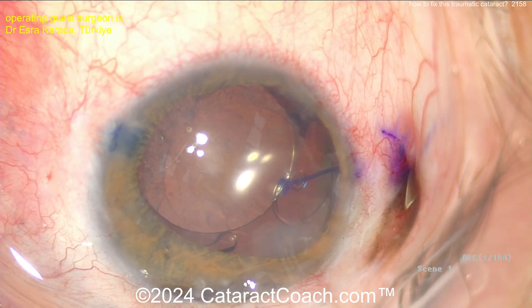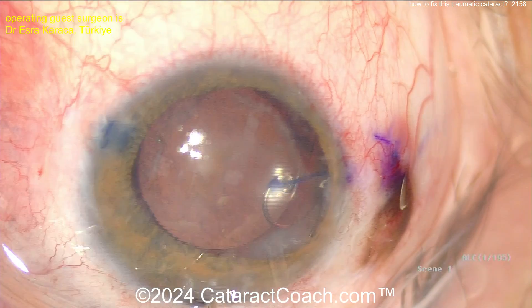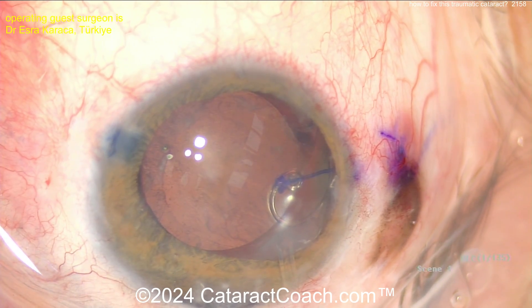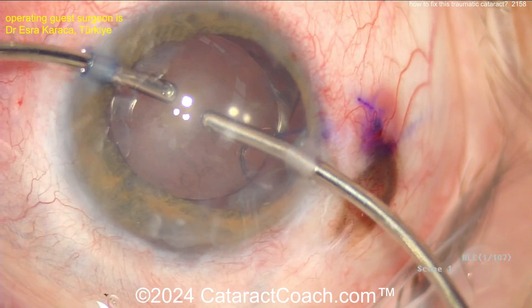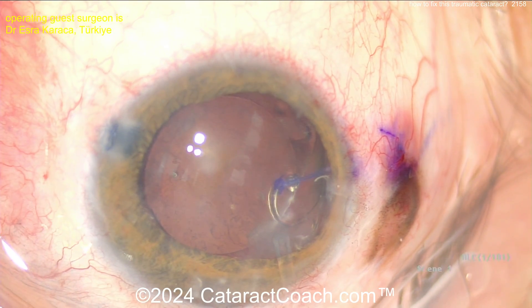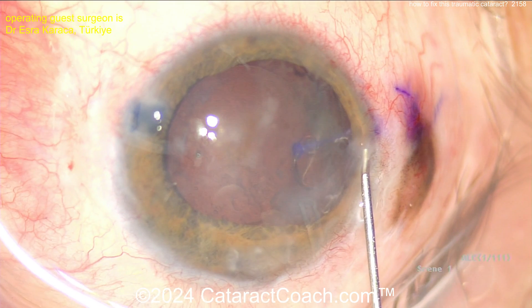I enjoyed watching this video — a nice step-by-step approach. Got to be cautious with trauma; you never know in these cases. Nicely handled with that vitreous prolapse. I may want to tighten up that prolene suture a little bit and have a smaller flange so it can be buried within the sclera and not just sitting under the conjunctiva. A neat case with a lot of great learning points. I'd also put a miotic agent in to bring down the pupil, and maybe restain with triamcinolone just to make sure there's no more vitreous prolapsed in the anterior segment.